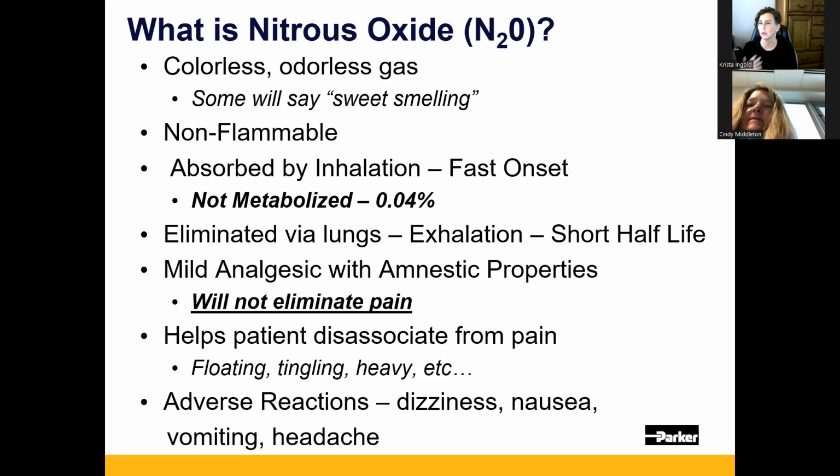So very quickly, if you give this patient 100% oxygen, either by closing your nitrous cylinder or just by throwing a non-rebreather on them instead, that will quickly dissipate and wash out the nitrous from their lungs. Within a minute or two, they'll be feeling much better. If they want to continue to use it, which is probably unlikely, they would just want to take more breaks, and not run into that, okay?